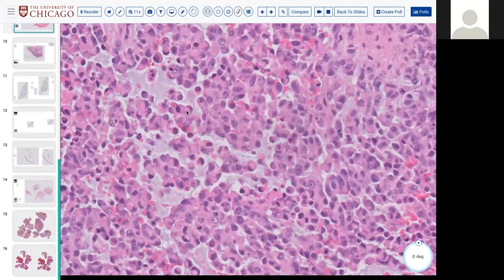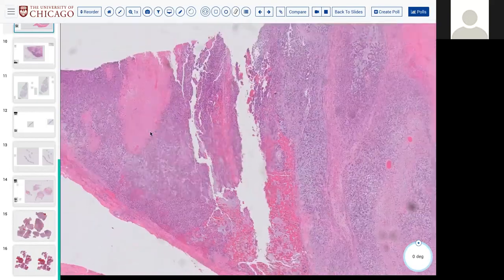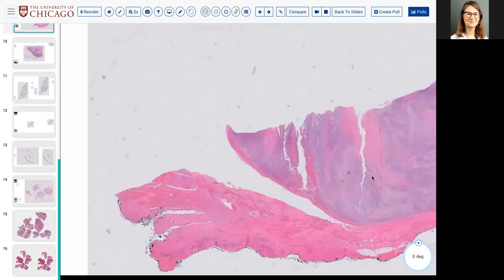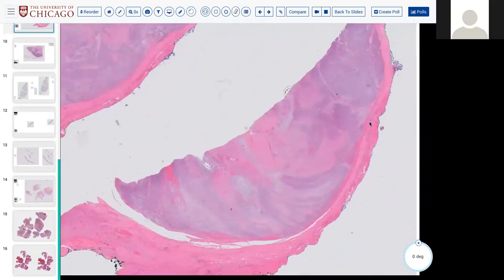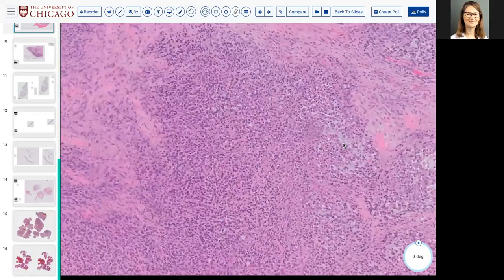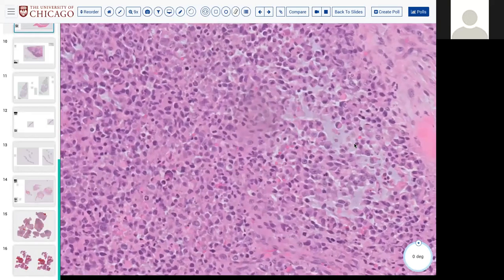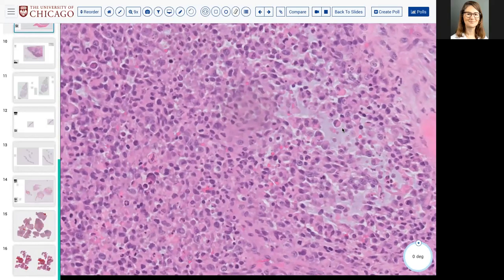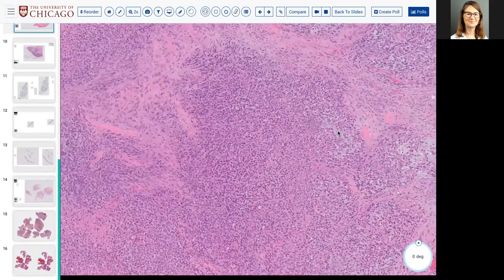It's a well circumscribed lesion as well, which we saw before, with a thin kind of pseudo capsule. And kind of vaguely lobulated. Okay. Awesome. So, older patient? Go ahead. Is this an older patient? No, this was a young guy, in his 20s or 30s. Does that change your thought?